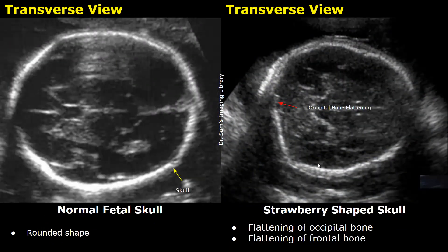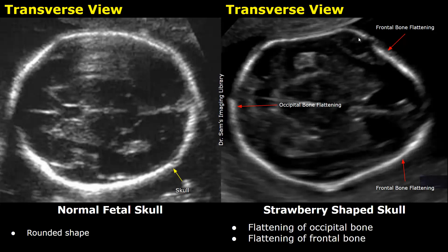The next feature is a strawberry shaped skull. The image on the left is a normal fetal skull with a rounded shape. In a strawberry shaped skull, there is flattening of the occipital bone — the occipital bone is flat. This feature is also associated with Trisomy 18. Flattening of the frontal bones can also occur along with flattening of the occipital bone, which gives a strawberry shaped skull.